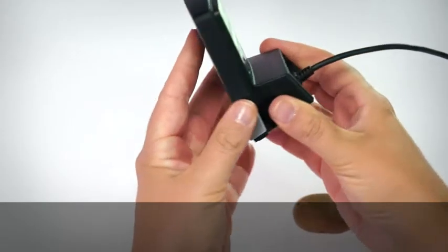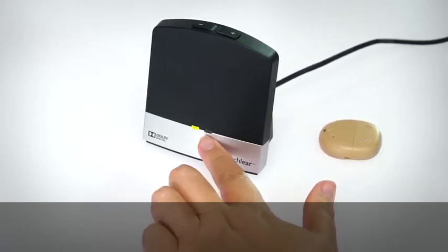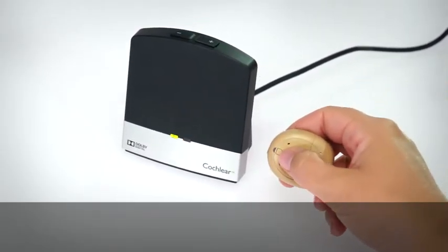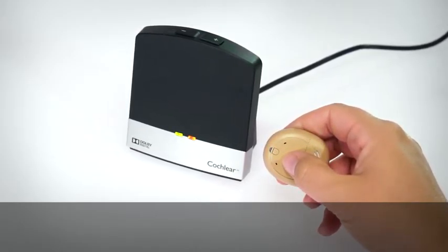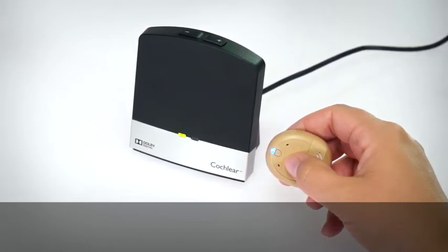Press the pairing button on your TV Streamer once. The activity light flashes orange for 20 seconds. You must turn on your processor during this 20 second window to pair it with the TV Streamer.